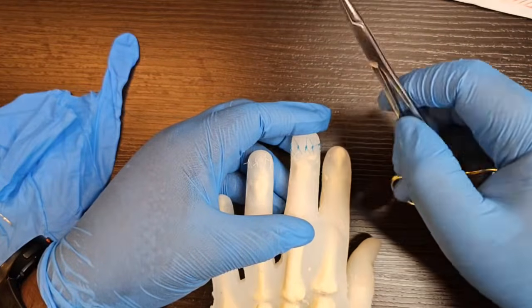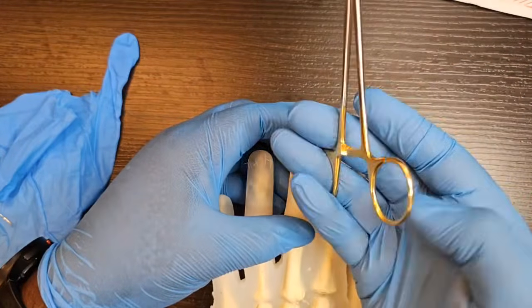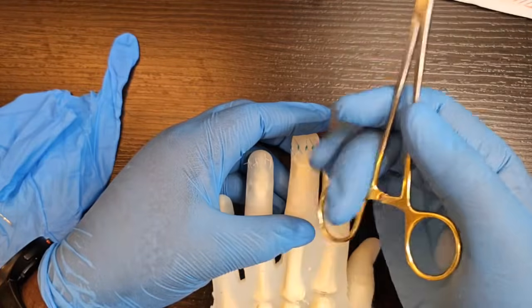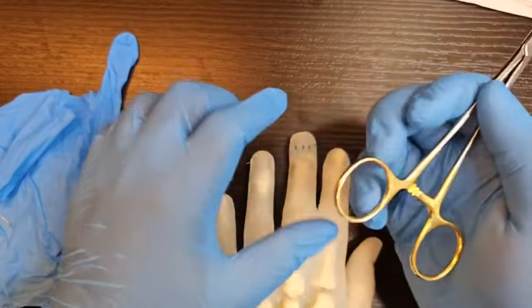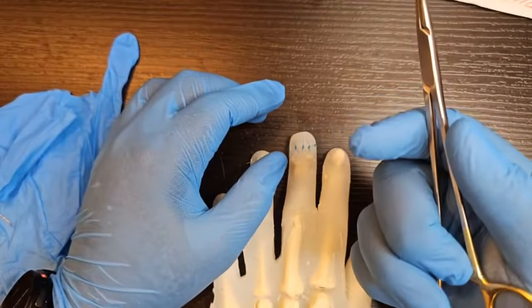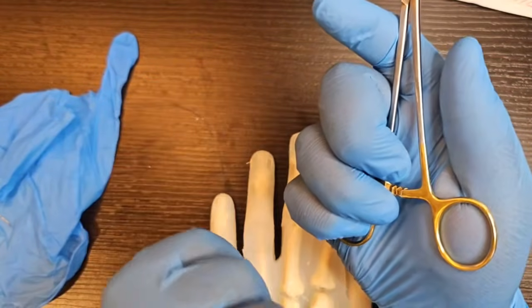Then, if I show you, I rotate, I put my ring finger in, I put my thumb in, I unlock the ratchet. The other way of unlocking the ratchet is just to push your thenar eminence into it. So I'll show you that again. Palmed, push, that comes up.